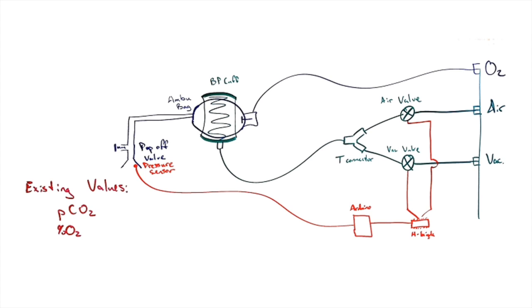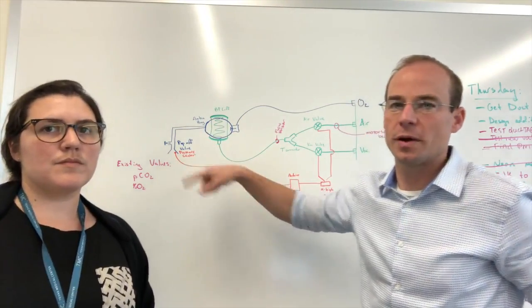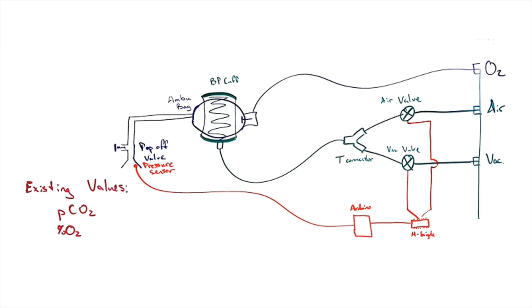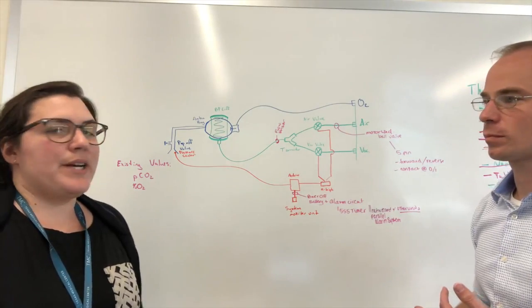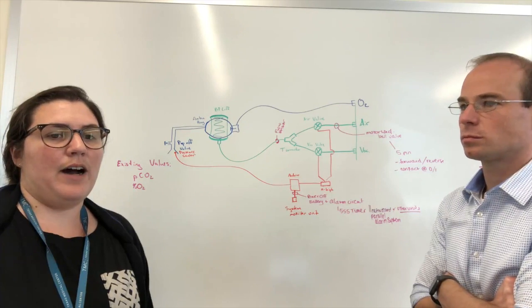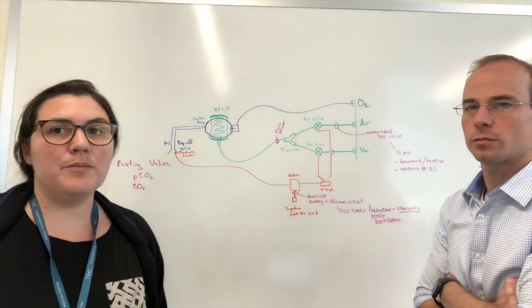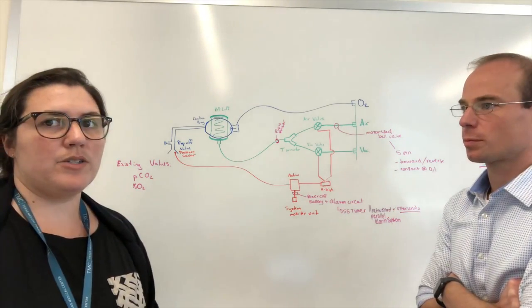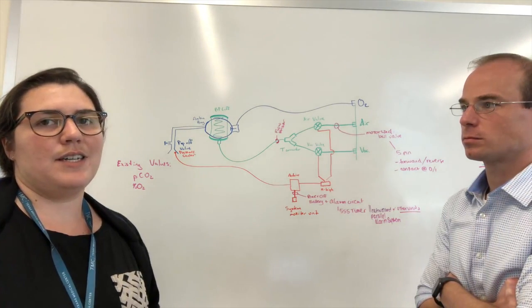The air valve opens to pressurize the blood pressure cuff and squeeze the mechanical ventilator that then supplies the air to the patient directly. And then the vacuum opens so that it suctions all the air quickly, because if you leave it to deflate, we cannot make the correct rates. We are operating at maximum parameters right now, so we know that every other second we can inflate the bag, or we can provide 550 tidal volume to the patient, and the maximum is 600. So we are within parameters, and now we're starting to implement control of the system and sensing of the system so that we could put safety guards in place.